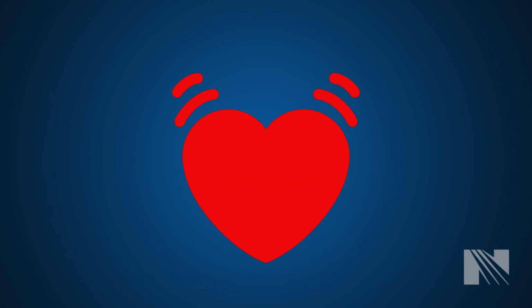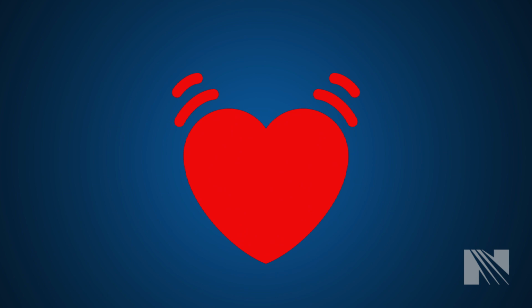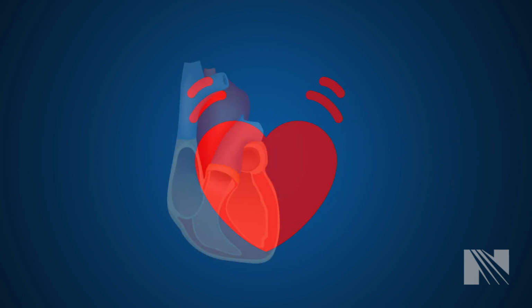If the pacemaker senses that the heart is beating too slowly or pausing too long, it sends an electrical pulse to stimulate the heart to contract and pump blood. This electrical pulse is very small and cannot be felt by the patient.